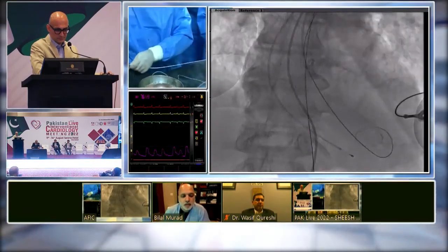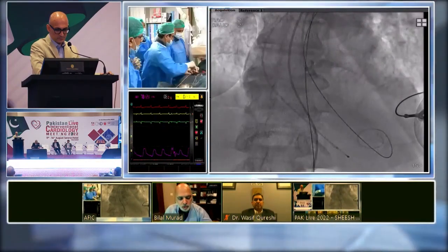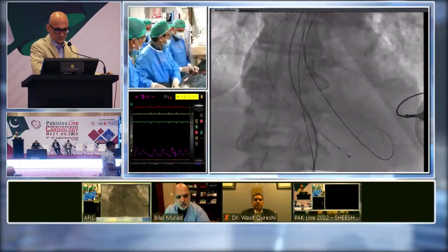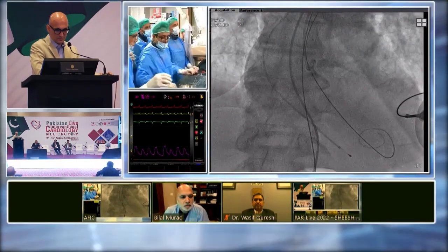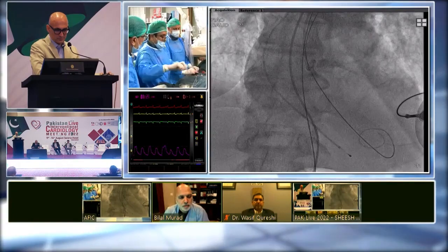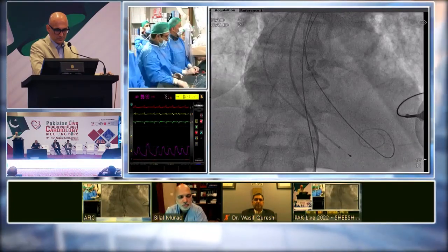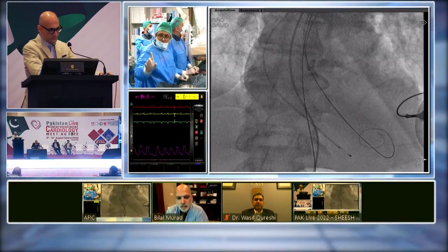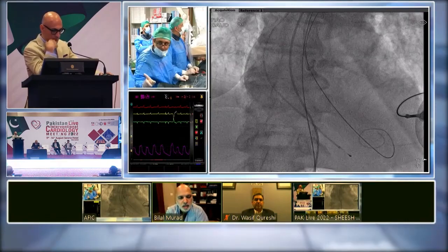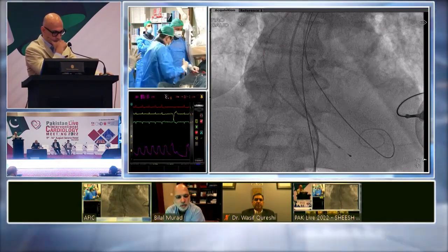I have completely changed our program. We used to be dual arterial access, but I think what COVID did is it forced us to rethink our program, given a situation of availability and staffing. And so we've actually moved to a same-day discharge protocol in selected patients. I actually eliminated the temporary pacemaker and now pace exclusively through the LV wire.